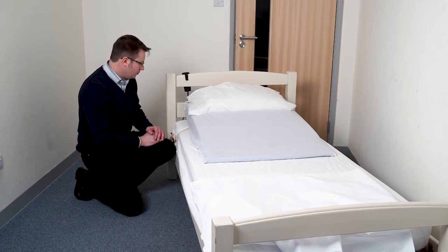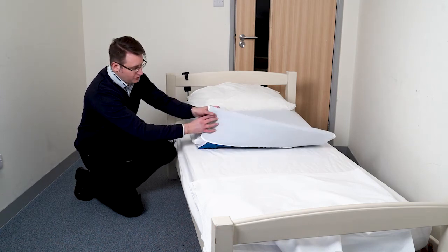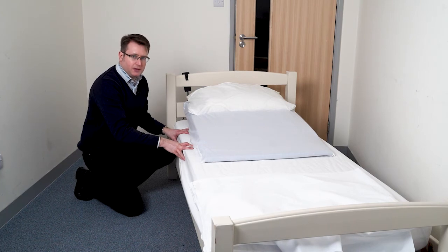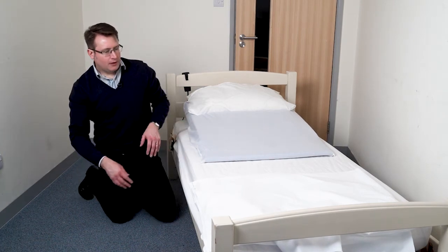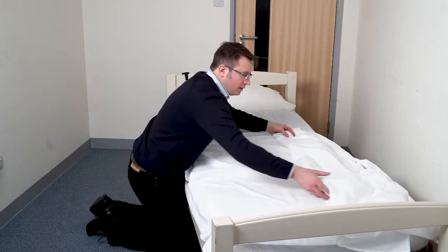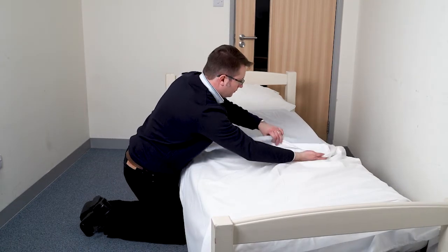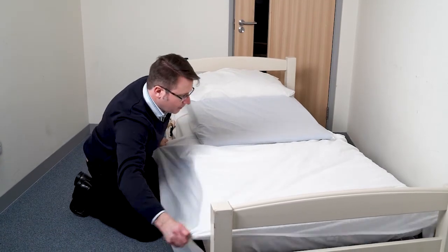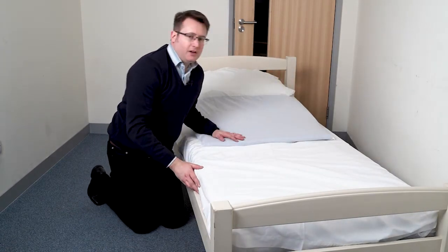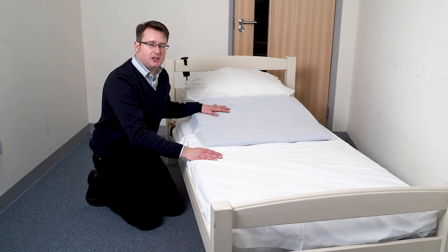Once the pillow lifter is fitted to the bed, and it doesn't really matter whether it's strapped or whether it's not strapped, it's easy enough to change the fitted sheet, which you can just take it off from the apron to take it off and wash it, but it's less easy to take off the sheet that's fitted to the mattress. A workaround that I found for this is that if someone wants to use half of a flat sheet, you can simply lift the bottom part of the pillow lifter, tuck the sheet under there, and then put it nicely onto the bed. And it just makes it an easier way that you can change the part of the sheet where your legs and feet are going to be at the same time that you change the fitted sheet on the pillow lifter.